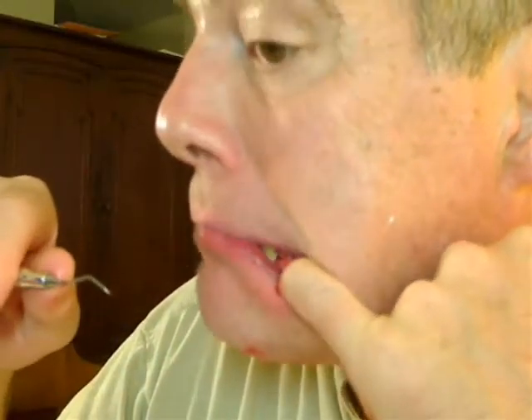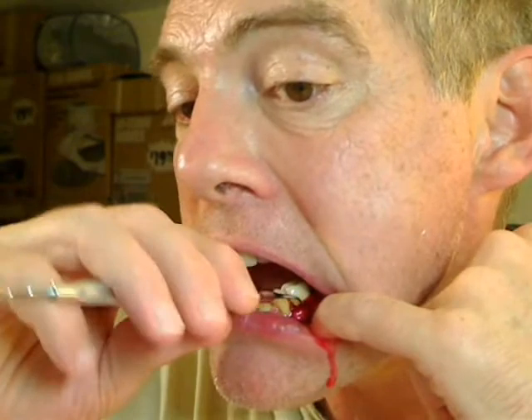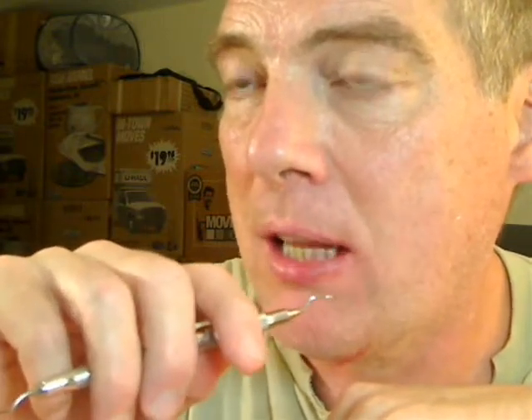I'm just going to use the Langer. As long as it's bleeding — you can see the one on the back is definitely liberated. The one on the front is more questionable. Just stick this thing in there and agitate. There's another one — another big nasty. The original concern was the front abscess. I surrounded the front abscess and wanted to try to get as much of the tooth as I can. Almost as a source of procrastination, I went to the back and started working it. Turns out there was an abscess back there that was pretty big.